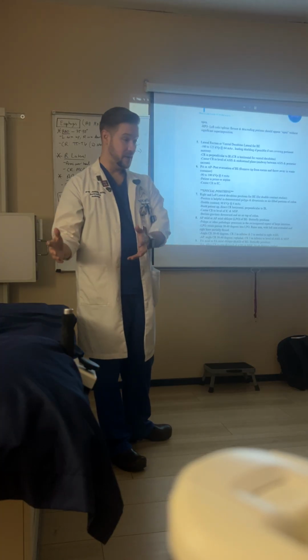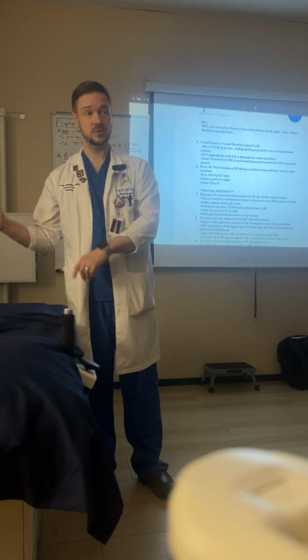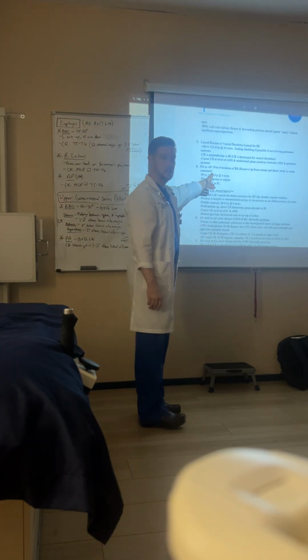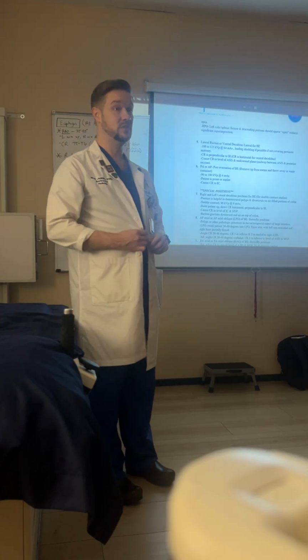And you're going to help them go to the bathroom and try to get as much of that barium out as they can. Then they're going to come back. They're going to lie flat for one more x-ray. That is the post-evac x-ray. Okay? This is our documentation to make sure that we didn't send them home with a gut full of barium.